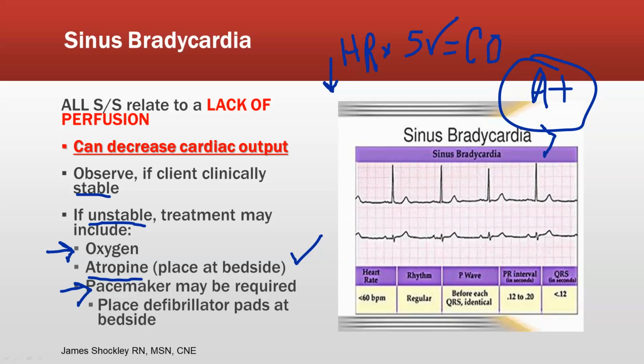Probably, if it continues to be symptomatic, what may need to happen is that I pace them externally. I put the pads on, we set the pacer for 80 beats per minute, and if your client's heart rate gets below 80, then it's going to shock them. As you can imagine, that probably hurts. Having never been shocked, I won't say that I know that it hurts, but I can imagine. We would probably do external pacing for a complete heart block, could potentially be second degree type 2, because we typically associate those with bradyarrhythmias.